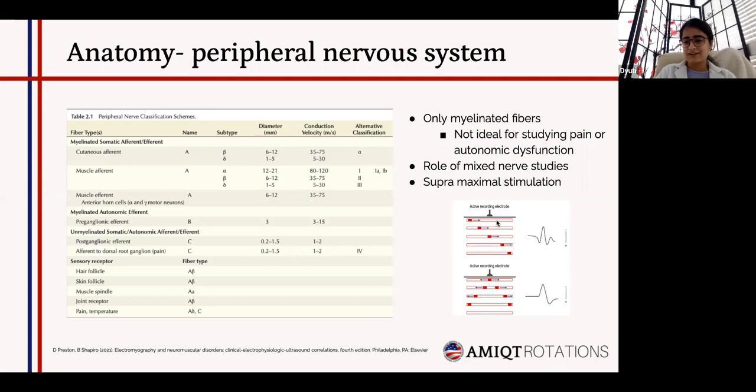So when we do a nerve conduction study, we use an active recording electrode that we place on the skin surface, and then we measure the extracellular recording of the intracellular changes that are occurring in the muscle or the nerve with the action potential. And by convention, the negative deflection is taken as upwards and the positive is taken as downwards.